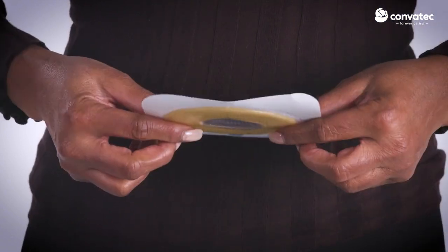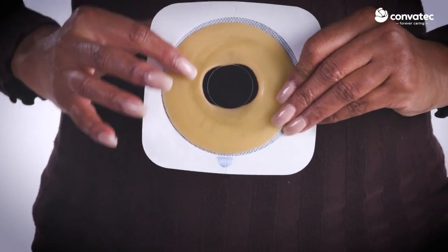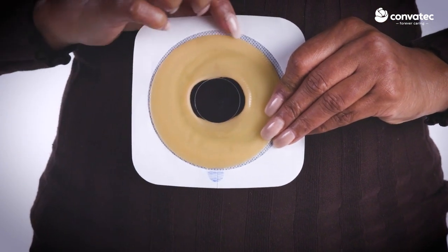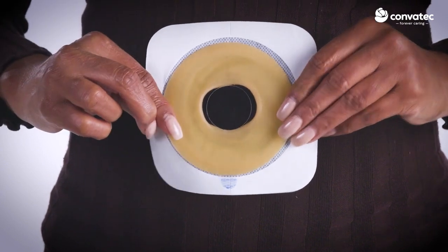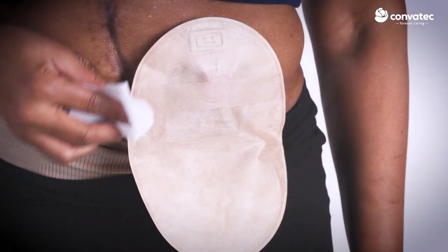Now, turn the base plate over. There is a clear cover backing over the adhesive center of the base plate with a blue tab for easy removal. You can also see a white release paper on the flexible collar. Both backings should remain on until you are ready to apply the base plate.